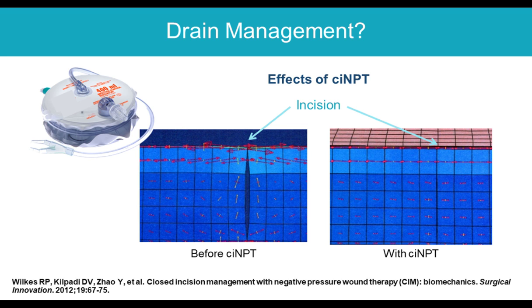The only thing that I do differently when using a drain along with a negative pressure dressing is that I want to tunnel that drain further away from the incision so that the footprint of the incisional negative pressure therapy is not disrupted when the drain is pulled a day or two after surgery.